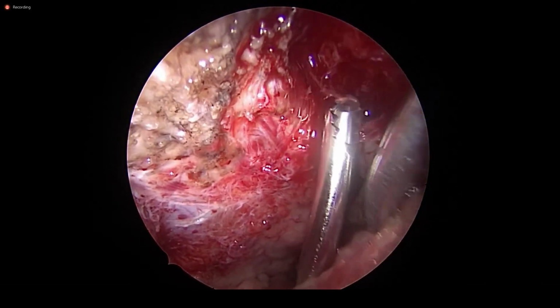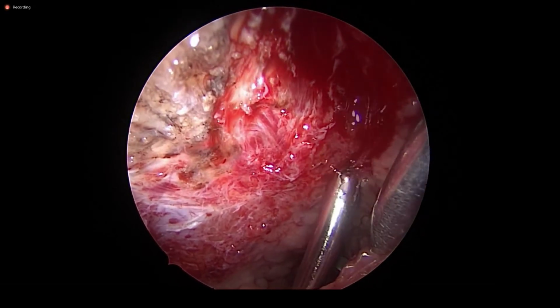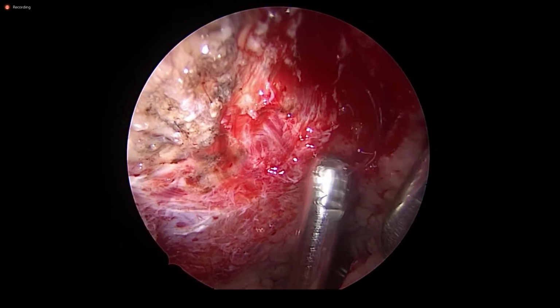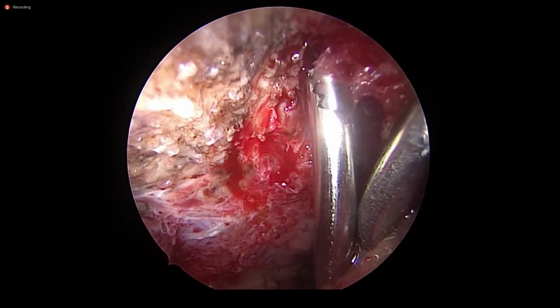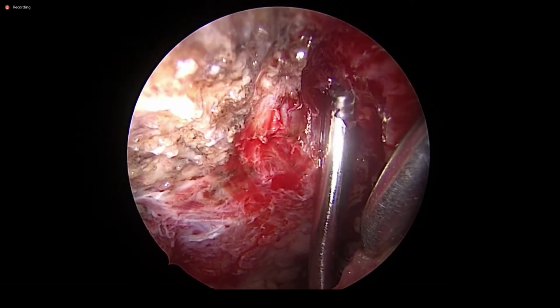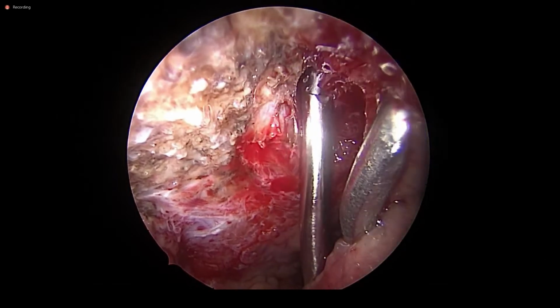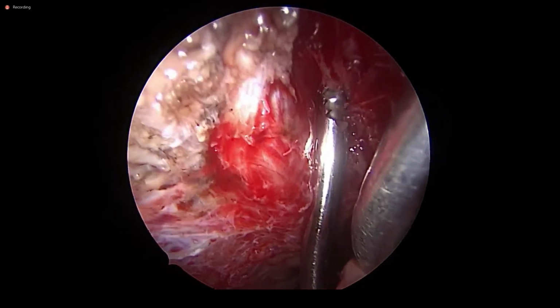This is behind the torus. I am behind the torus. Can you see? Yes, sir. I am not poking my blade anywhere. Absolutely under vision. See this? Only perimysium there behind. Can you see? Yes, sir.